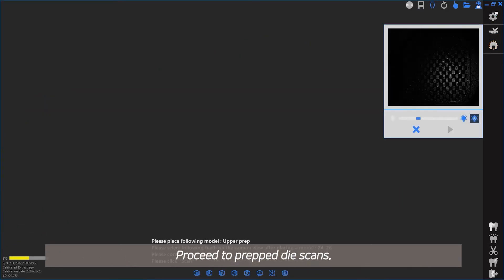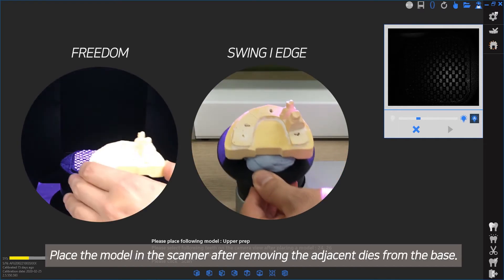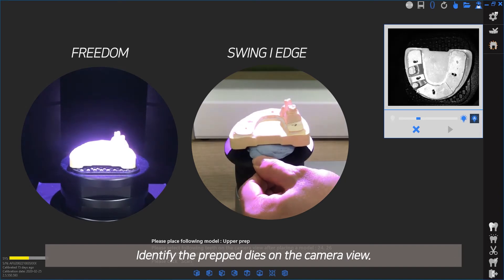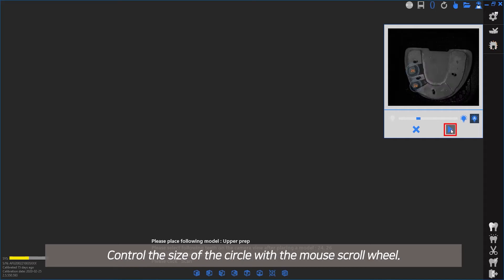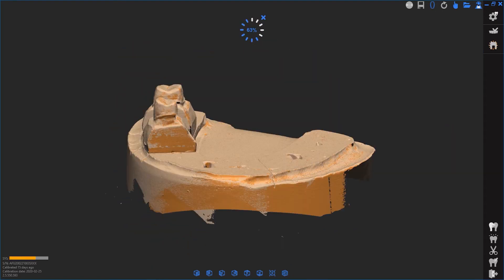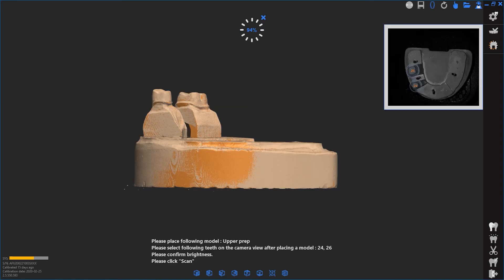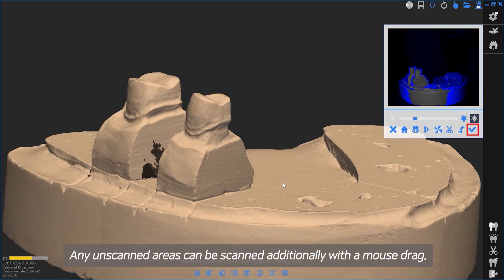Proceed to Prepped Die Scans. Place the model in the scanner after removing the adjacent dies from the base. Identify the prepped dies on the camera view and have the prepped dies fit inside the red circle. Control the size of the circle with the mouse scroll wheel. Any unscanned areas can be scanned additionally with a mouse drag.